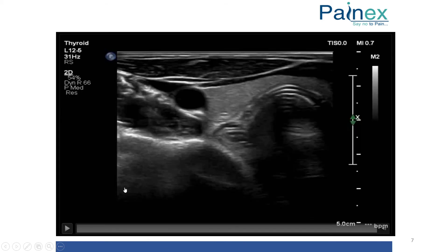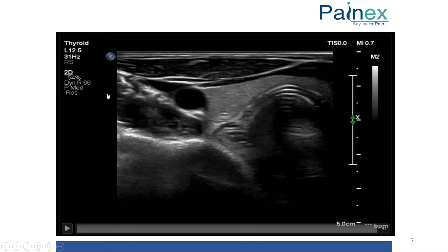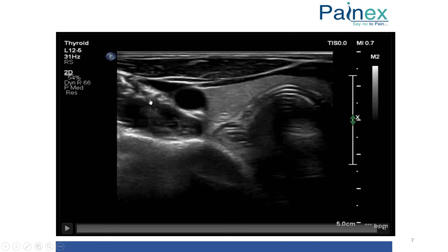This is an actual ultrasound image. The probe is kept at the midline — this is the medial side, this is the lateral side. We can see a nice trachea, esophagus, thyroid, carotid, and IJV. There is a transverse process here. This is the C7 transverse process and this is the longus colli muscle. All the structures — stellate ganglion, vagus nerve, recurrent laryngeal nerve — lie in very close proximity.